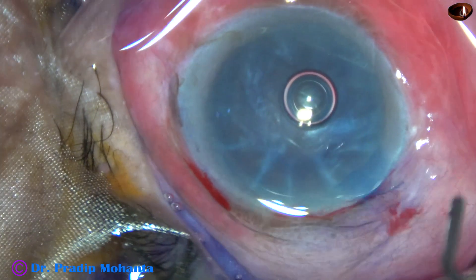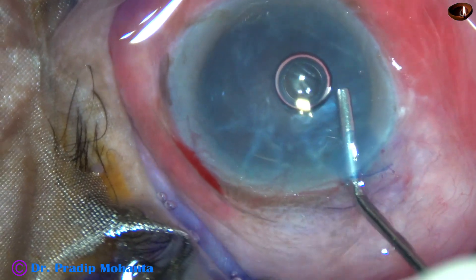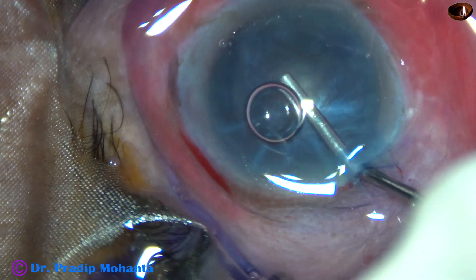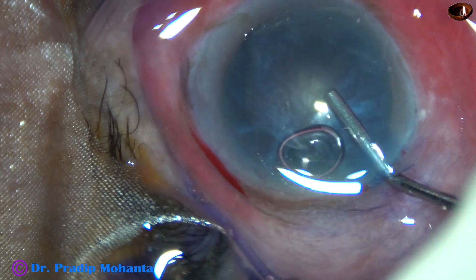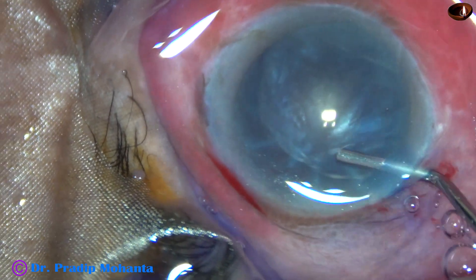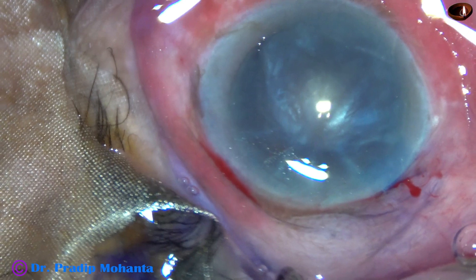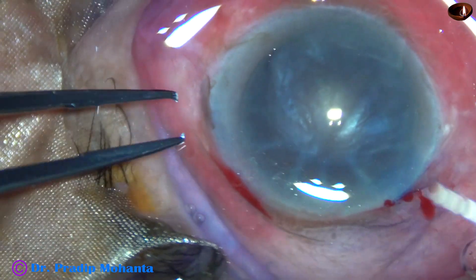Now 2% hydroxypropyl methyl cellulose is injected to fill the anterior chamber. There is an air bubble; it has to be removed. Some more visco is injected and the air bubble comes out.